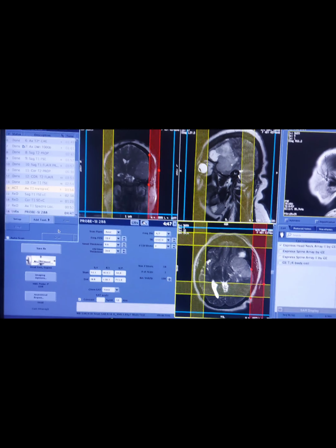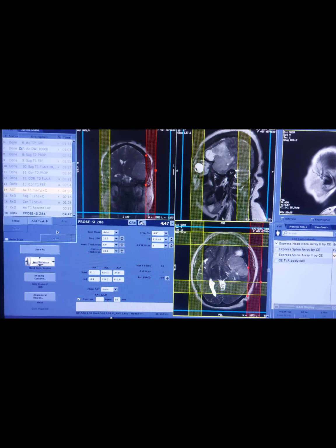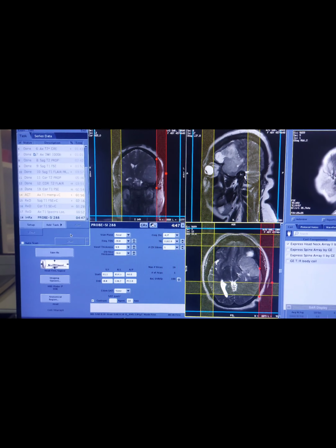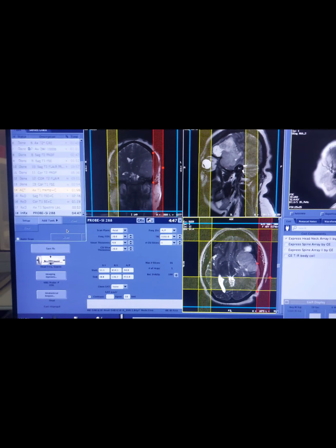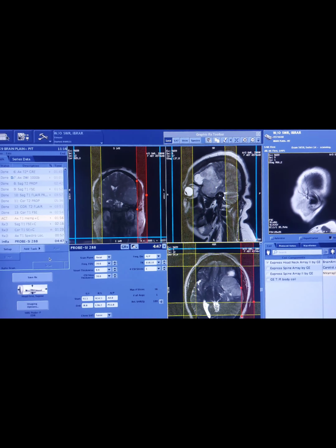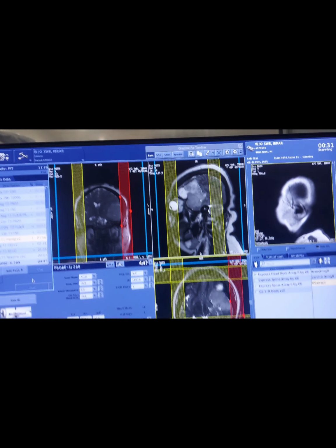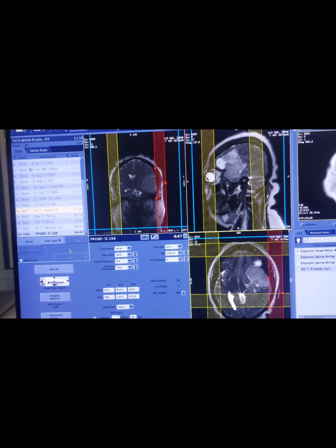Welcome back. Today we are going to learn MR spectroscopy for brain. Spectroscopy is a diagnostic test for measuring biochemical changes in the brain, especially in cases of tumors. Different chemicals are analyzed to make the diagnosis for different types of tumors. The chemicals that are analyzed include choline, creatine, myoinositol, and NAA, and others also.